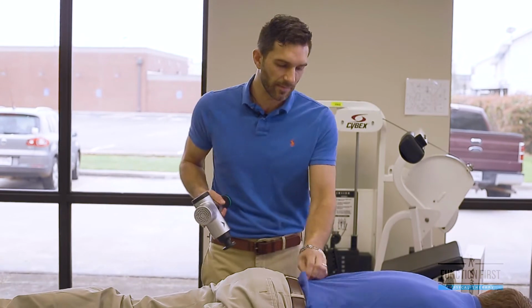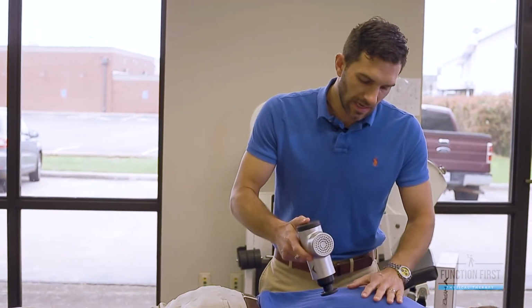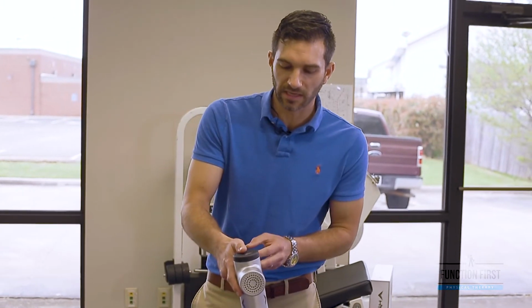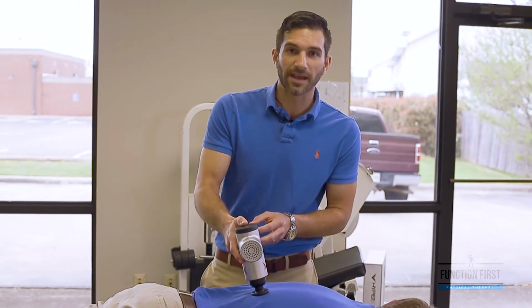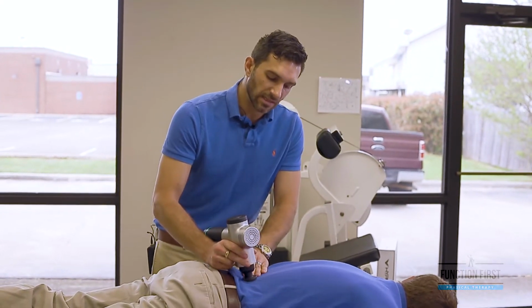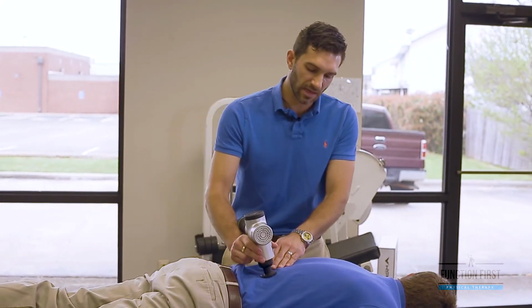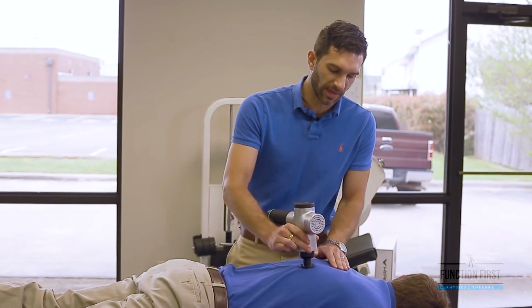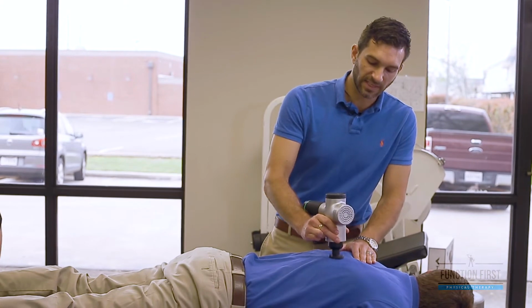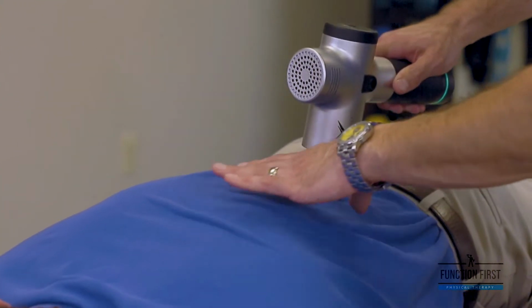Let's say what we use this machine for the most is definitely the paraspinals. Patients come in with a lot of back pain sometimes. They're real sensitive. Sometimes they can't handle this, but it's definitely always a goal to build them up to be able to handle the Hypervolt. And a lot of our patients, like Dennis was saying, they might come in with some acute pain, or it might be more chronic pain, but it's definitely a go-to 5-10 minute treatment with our back pain patients, and it's pretty effective.